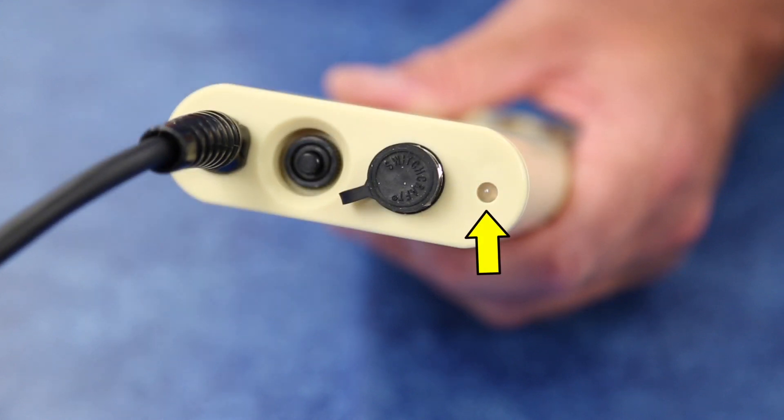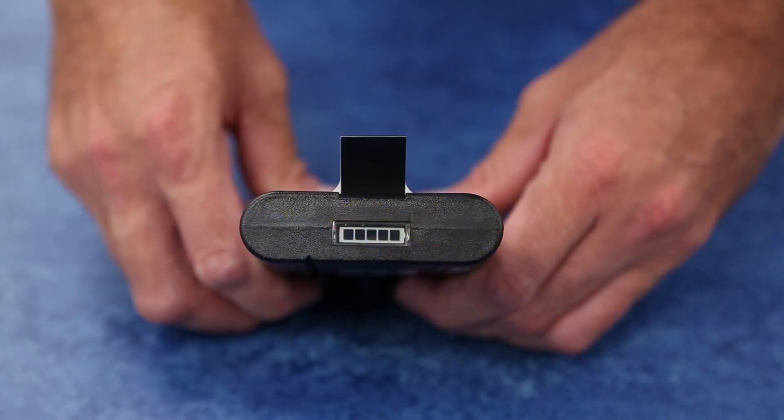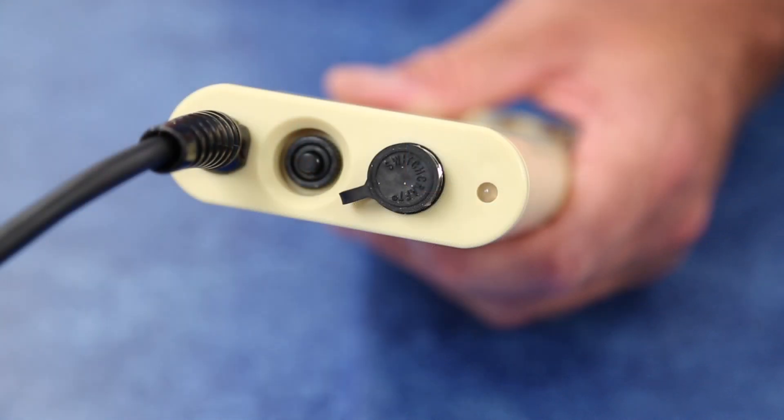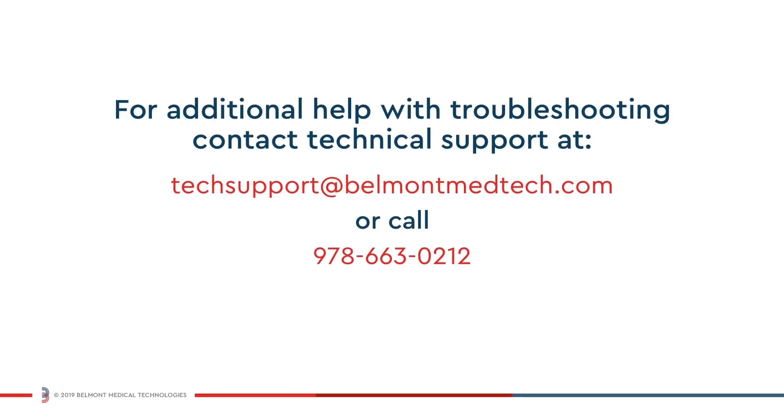If the blue LED does not illuminate, make sure that the battery is charged. After confirming that the battery is charged and the LED still does not illuminate, please contact customer service for assistance.